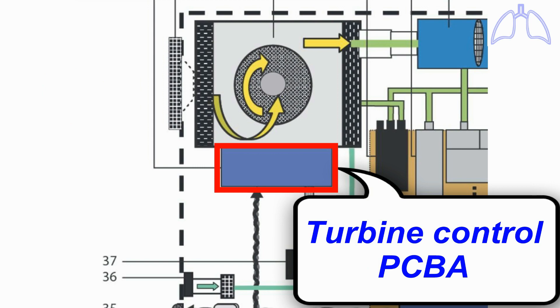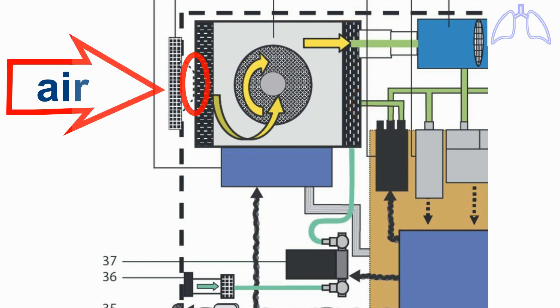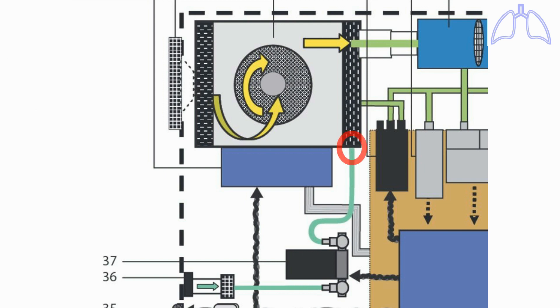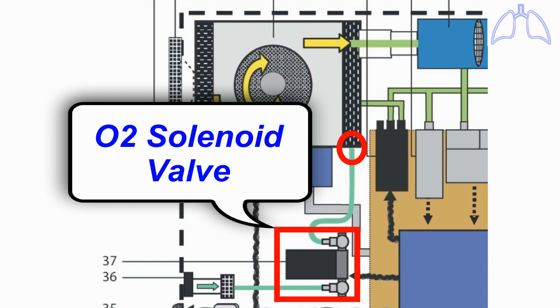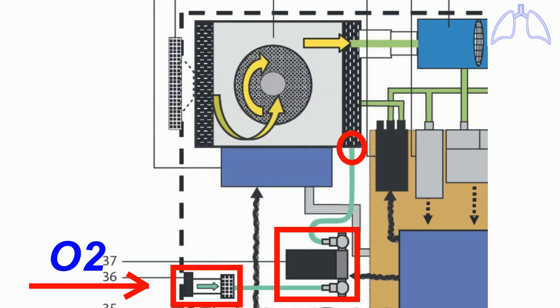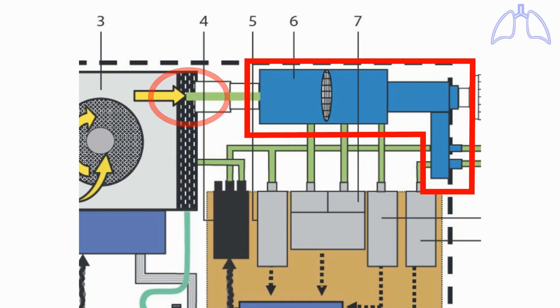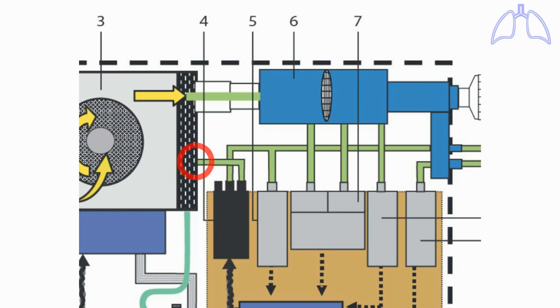The turbine control PCBA controls the turbine. The turbine has two inputs and two outputs. The first input is used to insert air from the atmosphere. The second input is connected to the oxygen solenoid valve, which receives oxygen from the low-pressure oxygen inlet. The first output is connected to the inspiratory block. The second output is connected to the exhalation solenoid valve.